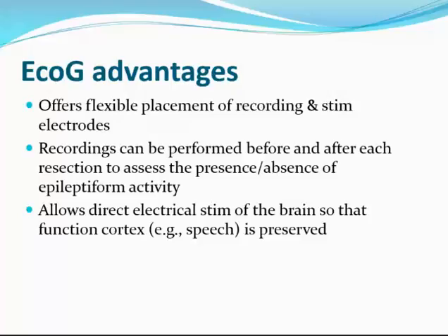The recordings can be performed before and after each resection to assess the presence or absence of epileptiform activity. It allows direct electrical stimulation of the brain so that functional cortex, e.g. speech, is preserved.